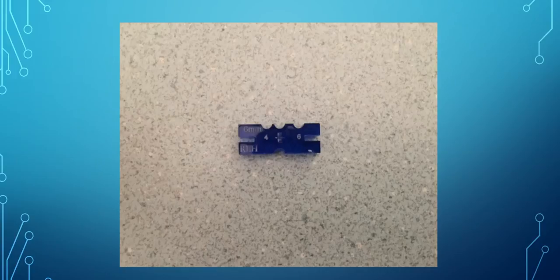This is a standard jig. This is a 6mm with 4mm or 6mm end-to-end. In our case, we're going to be using 6mm end-to-end to start.